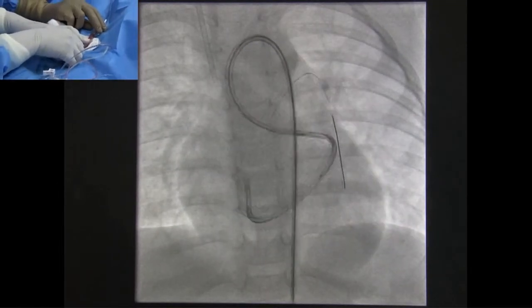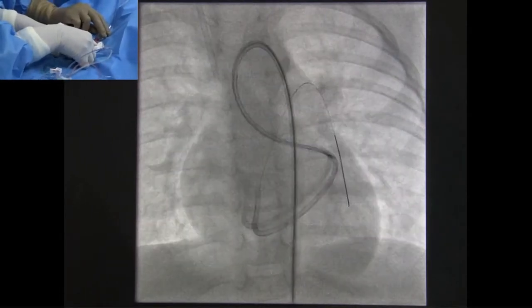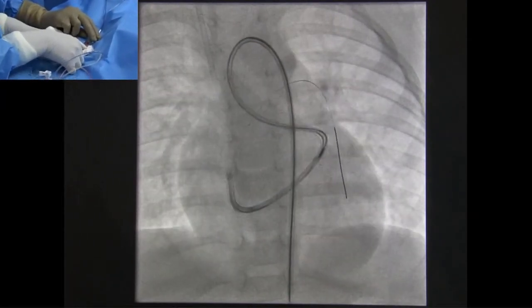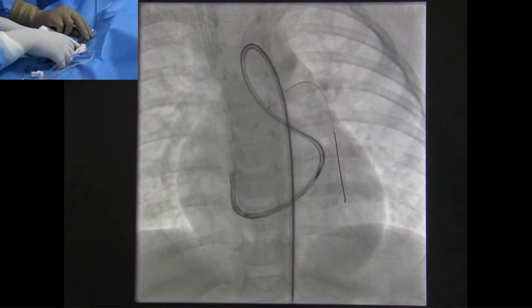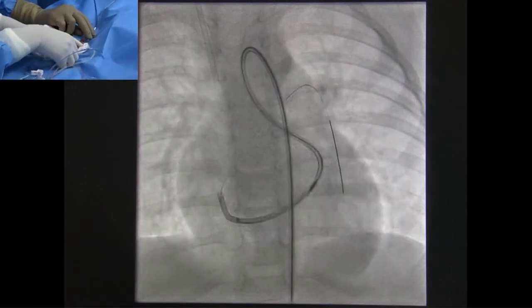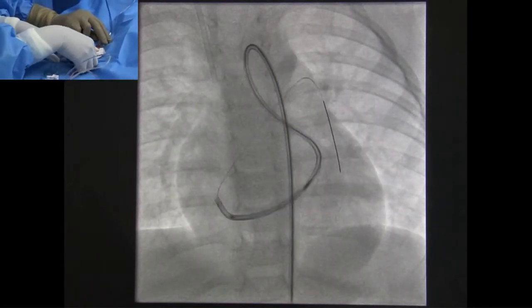Your device is reaching the middle of the circumflex and she is feeling a little tightness, but however, manage. You will feel it, because at this point is where you feel the maximum resistance when you have a buddy wire, and that is the slightly difficult part of it. You will also experience difficulty in taking out the wire once your device comes out, Nageshwar, and it can be very challenging. So I would encourage you, as soon as your device is slightly out, to remove the wire. Just go gently, because it becomes very difficult to take it out once your disc expands.